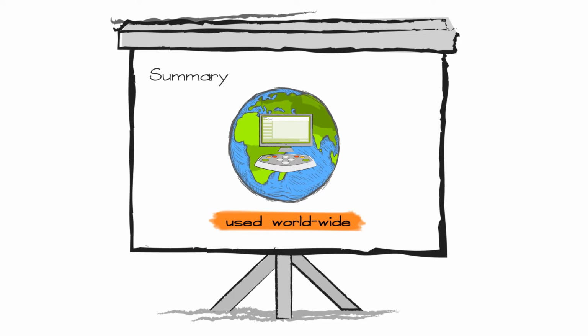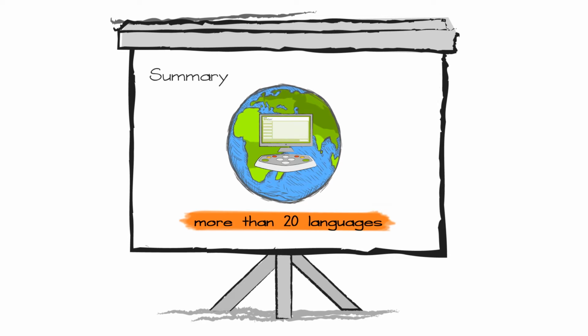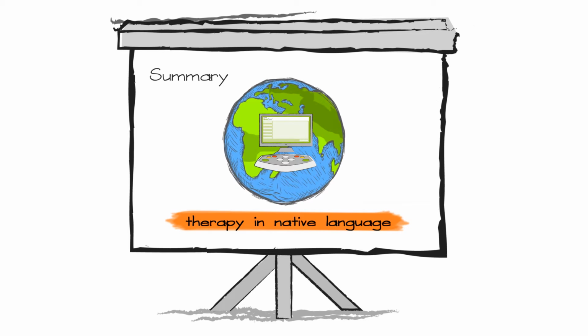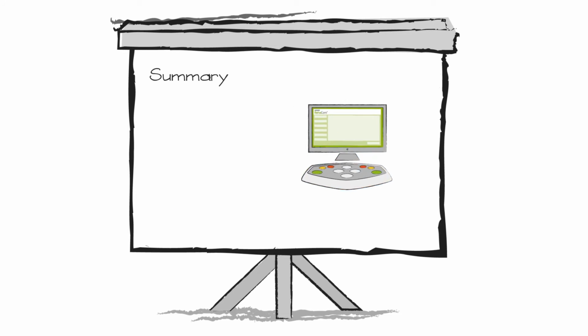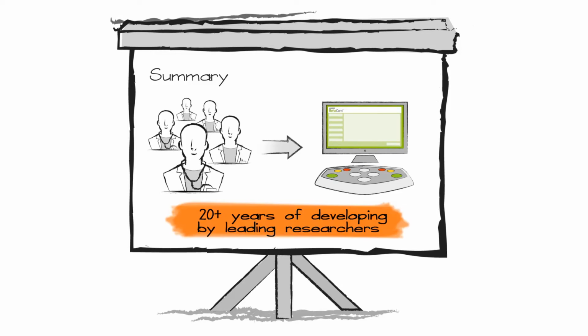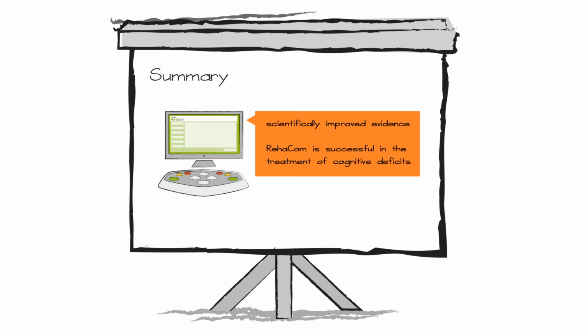RehaCom is used worldwide. Available in over 20 languages, nearly every patient can use RehaCom therapy in his or her own language. Leading researchers in the field of cognitive rehabilitation have been developing RehaCom for more than 20 years. There is strong, scientifically proven evidence that RehaCom is successful in the treatment of cognitive deficits.